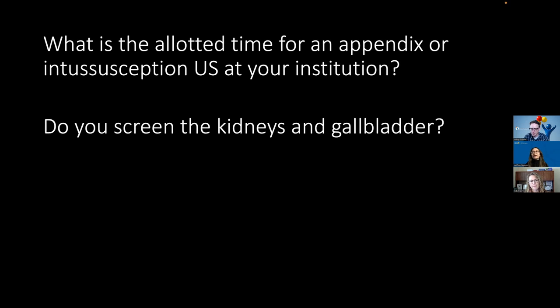Yeah, I was kind of a firm believer because I worked at Texas Children's for about 5 years prior to coming to CHLA. And we just stopped screening because we didn't find the utility in it. And so once I got here, I was like, oh man, this is kind of ridiculous. But then, it's not too infrequent that we find other abnormalities on our exams. So I'm starting to change my tune.